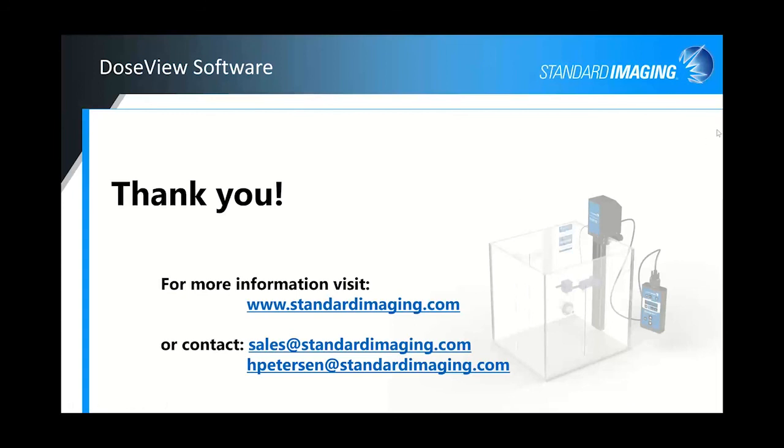And it looks like I may have a question. Let's see. Do we have plans to include the UK and European protocols, IPEM and DIN, etc.? We do in future versions of the software. We've been adding a few different ones along the way. We've added, I think, the Japanese-specific protocol and the Indian protocol right now, but we are looking at the other protocols to add also.